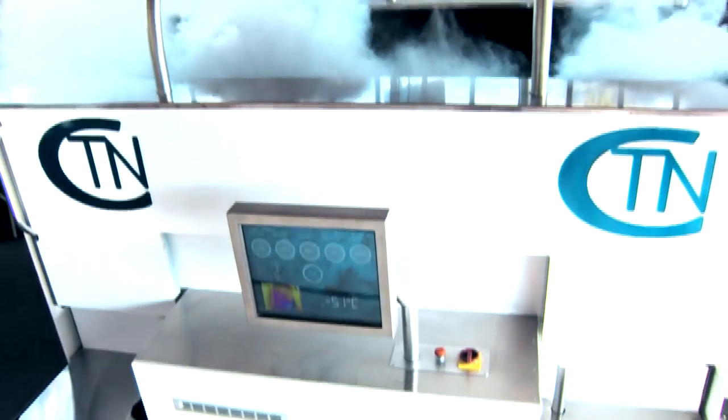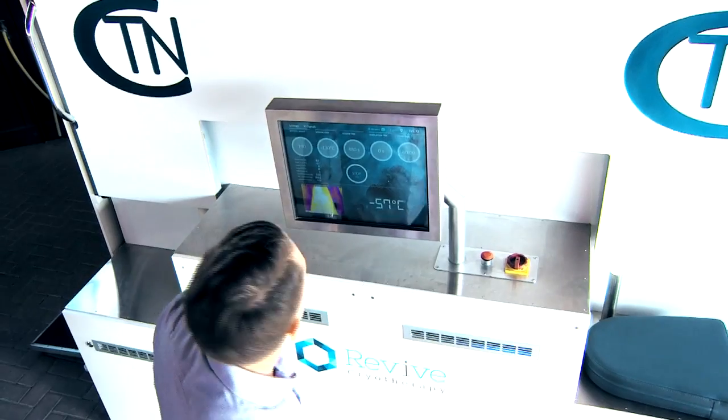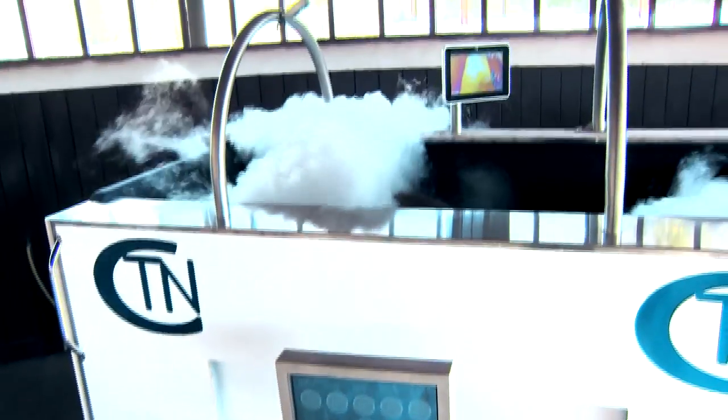Horses spend around 8 minutes in the cabin. Jockeys, by comparison, would only be able to manage around 3. We found out more about how it actually works from General Manager Luca.